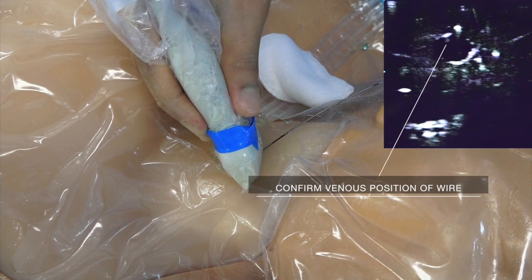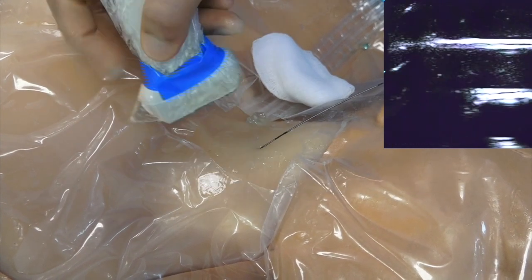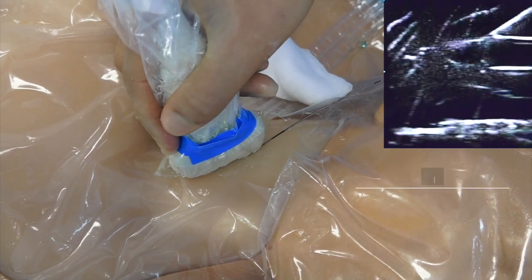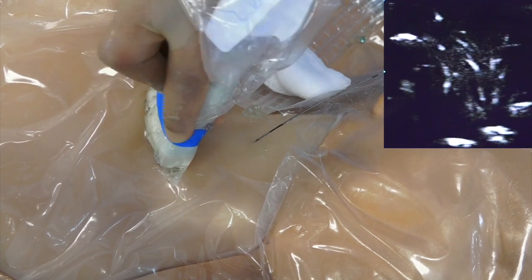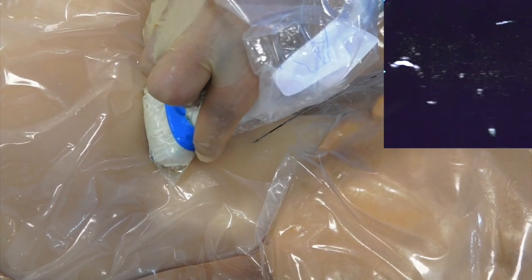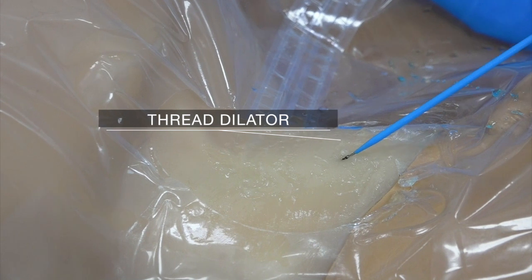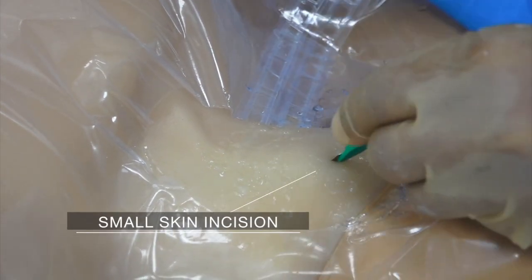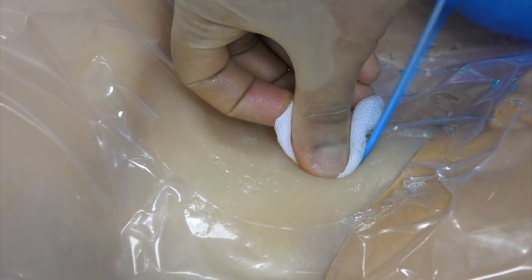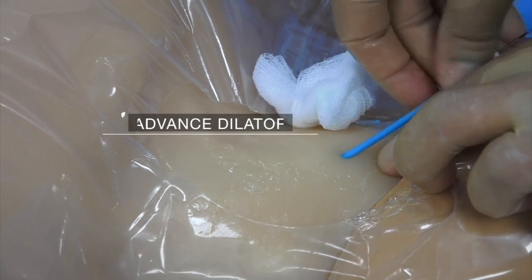We now must confirm the wire lies in the internal jugular vein. This can be done by tracking its course from the skin into the vein using both a transverse and a longitudinal ultrasound view. Then trace the wire into the chest to ensure it lies in the superior vena cava. If this is the case, the wire will plunge downwards on the ultrasound screen. Once satisfied with the position of the wire, thread the dilator onto it, then use a scalpel to make a small skin incision at the point where the wire meets the skin.